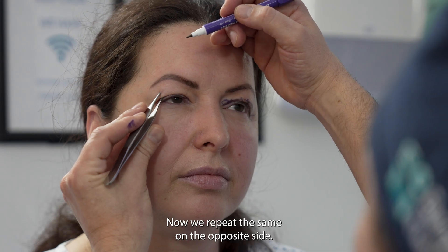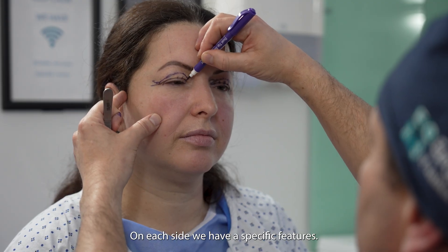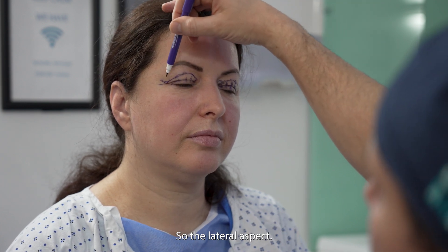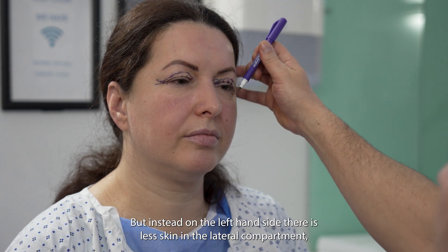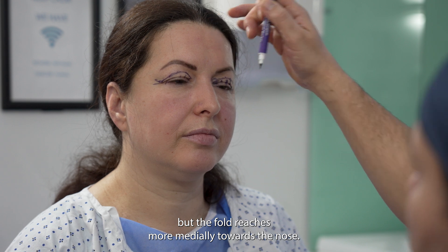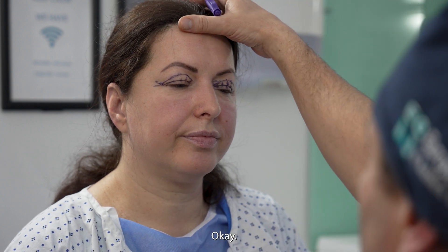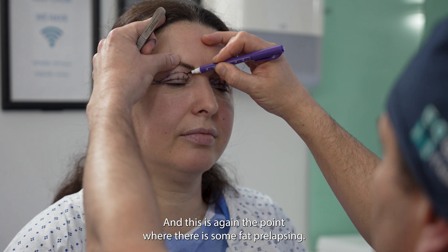Now we'll repeat the same on the opposite side. Each side has specific features. On the right-hand side it becomes obvious that she has more skin hanging towards the outer canthus — the lateral aspect. On the left-hand side, there is less skin in the lateral compartment, but the fold reaches more medially towards the nose. So the excision of skin is not going to be exactly symmetric. And this is again the point where there is some fat prolapsing.